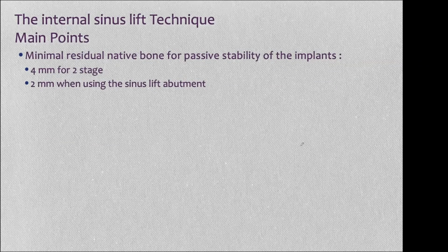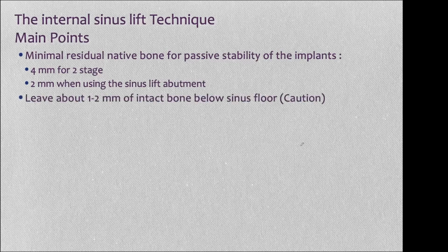will find at least some pointers that will help you treat patients with the internal lift using ultra short implants and the SynthoGraft. Now, we beat that point, I think, to death with respect to the different depths that you can work with. But what you do is, as you are preparing the osteotomy, it is not a complete osteotomy, obviously. You are going to prepare to within a millimeter, 2 if you have fairly soft bone, of the floor of the sinus. Now, how do you know where the floor of the sinus is?